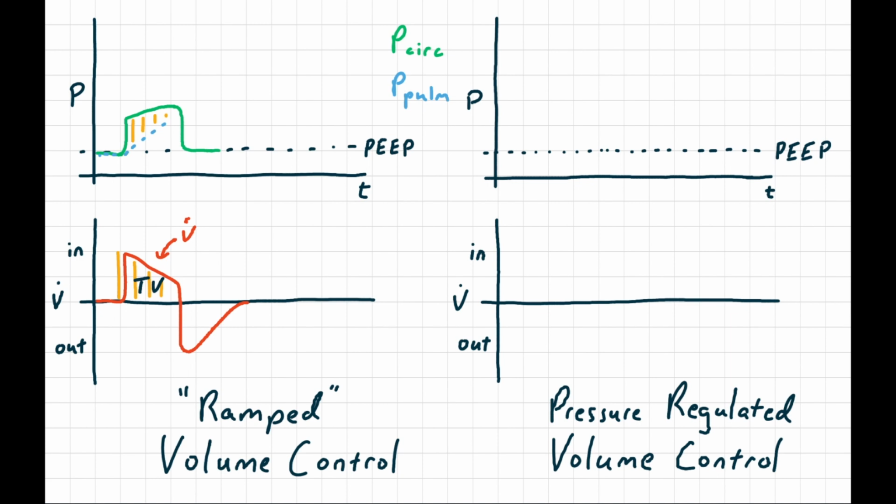The other general way to approach the best of both worlds question is with pressure-regulated volume control. This mode, despite the volume control name, is actually a pressure-limited mode. So let's look at how pressure-regulated volume control, which you'll also hear called pressure control with volume guarantee, works.